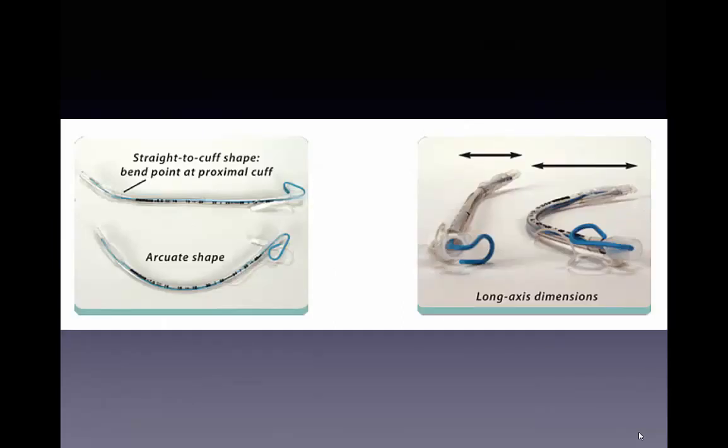Let's talk briefly about the endotracheal tube itself. You'll be handed the tube by the respiratory therapist with lubrication already on the tube, certainly towards the front of the tube where the cuff is. It's also important to make sure that your stylet is lubricated so that there's no inadvertent extubation of the patient once you've actually successfully passed the tube.